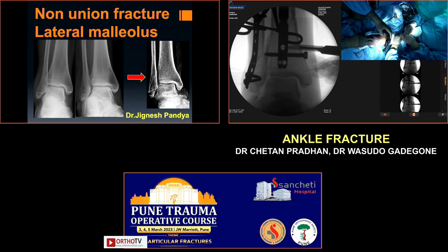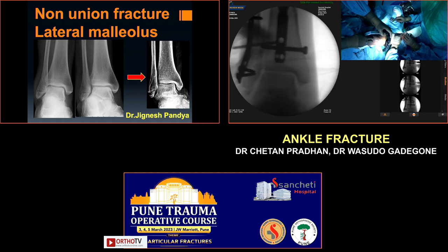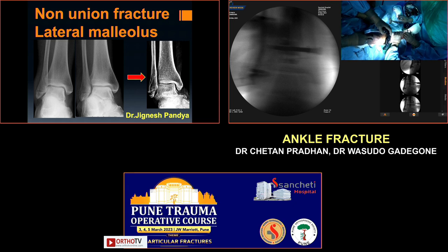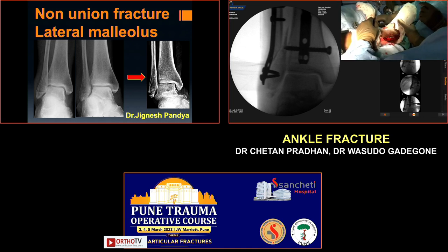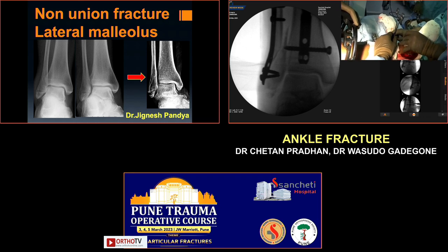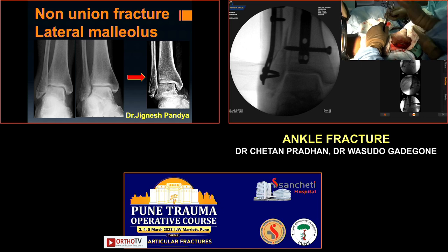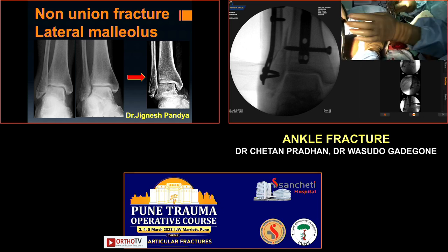Sir said no nailing or no wiring. No, nailing can be very well done in a transverse fracture. So if it's a non-comminuted transverse fracture of the fibula, nailing can be done, is what I said. Absolutely. Another fibula medullary cavity will not all the time accommodate even 2 millimeters. Sure. So you'll have to first see the fibula medullary cavity. If it is big enough, then it is a different thing. Otherwise, a 1 millimeter wire, if you put it, is not good enough. Yes, that is a very valid suggestion. You have to see the medullary cavity.